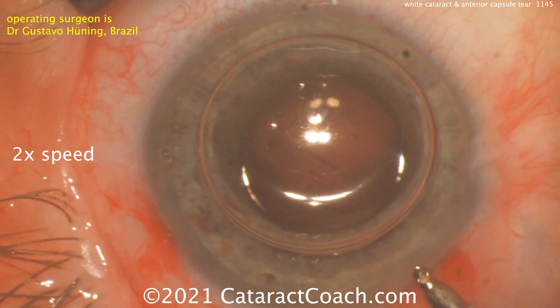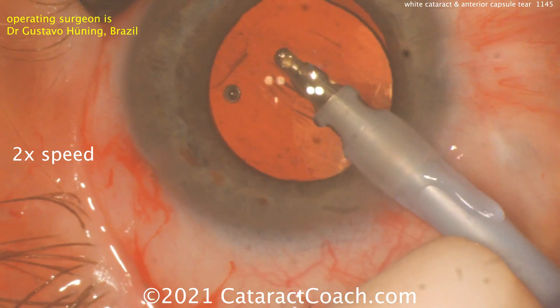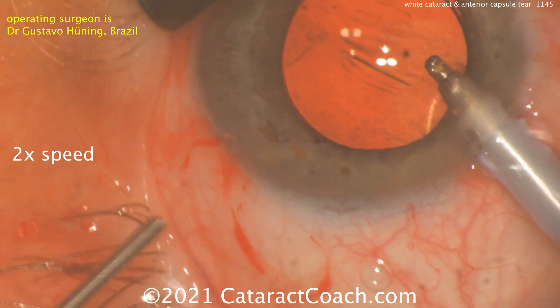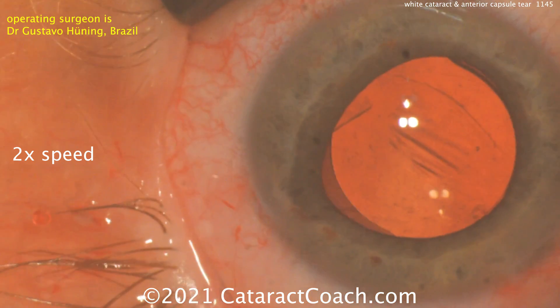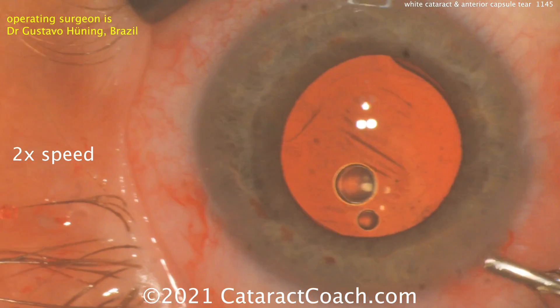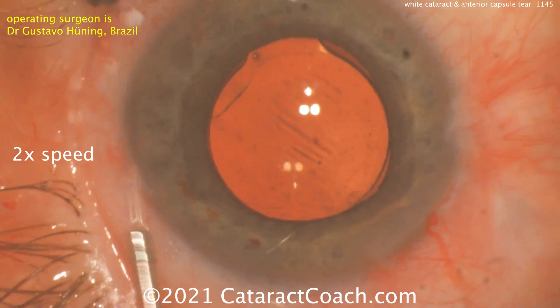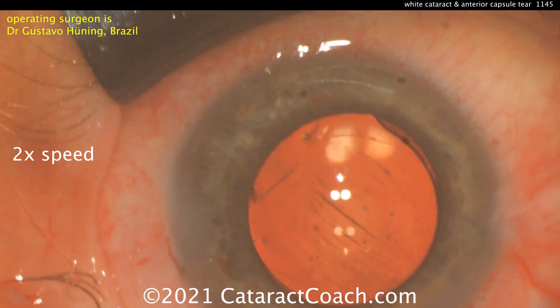In a patient like this, remember the lens calculations. If you are planning on leaving silicone oil in the vitreous cavity, that definitely changes your lens calculations. If you do nothing, the patient is going to end up very hyperopic afterwards. You really need to add a lot of power to the lens — usually four, even five diopters of power added to the IOL in order to achieve close to your target. There's good information about that on CataractCoach.com — just search for silicone oil and it'll teach you all about those lens calculations. One little bubble of silicone oil left there; that looks pretty reasonable.